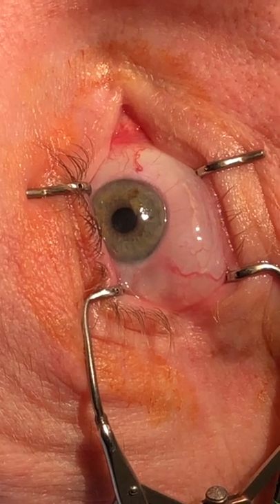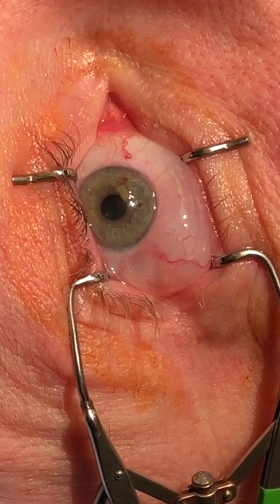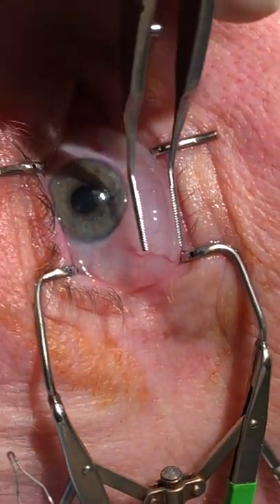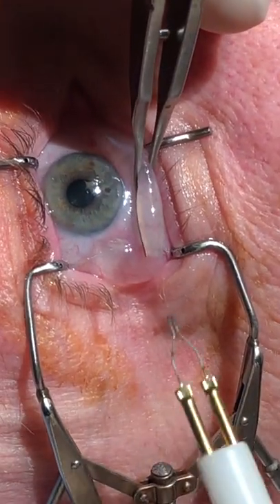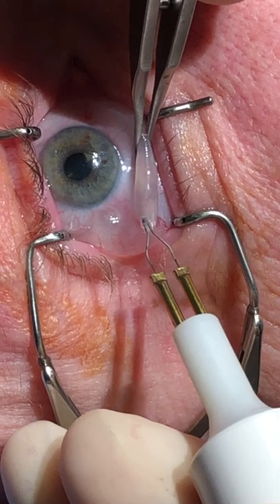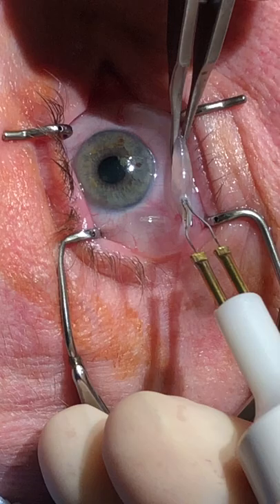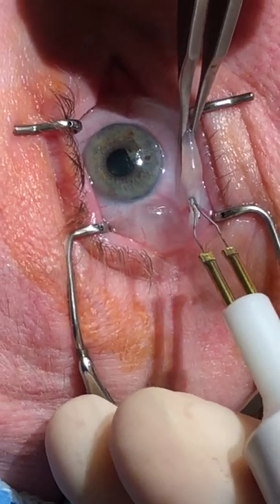I have a special little instrument here — it's kind of like a little hockey stick instrument. Basically we go to the excess conjunctiva and then we're just cauterizing. This is a low-energy cautery.